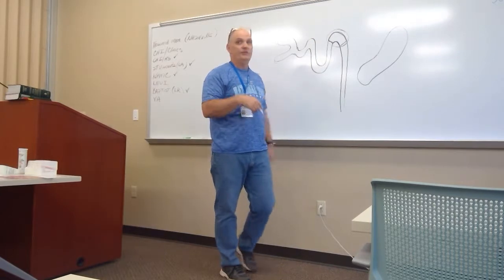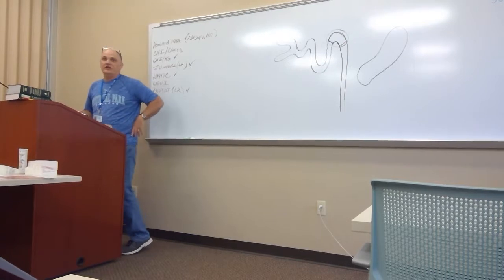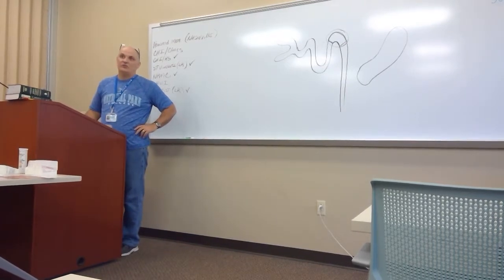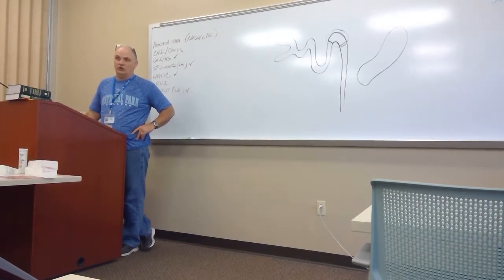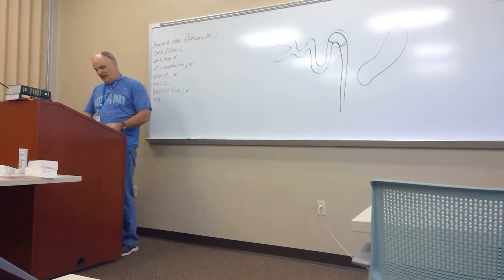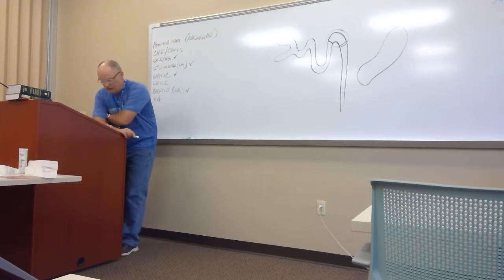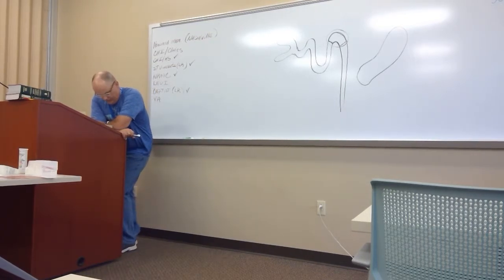All right? There's different types of cast. I think the question that they'll normally ask you about cast is what's the protein that makes up the cast matrix called, and it's uromodulin. It used to be called Tamm-Horsfall protein, and they've changed it on me, so I've got to make sure I've got that right. So we've got to talk about all the different types of cast. On page 122, under cast composition and formation, the very first sentence says the major constituent of cast is uromodulin.